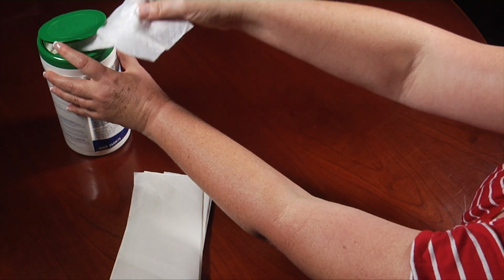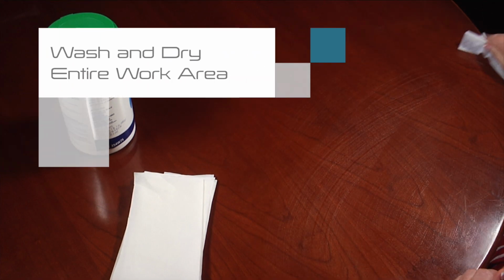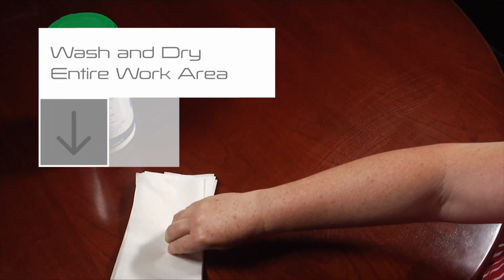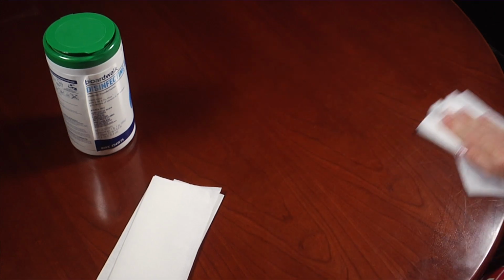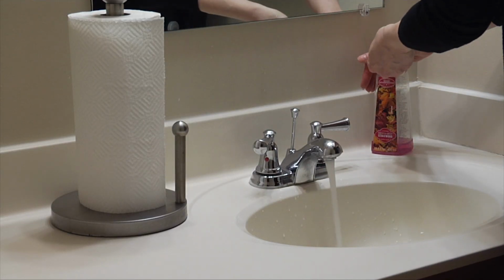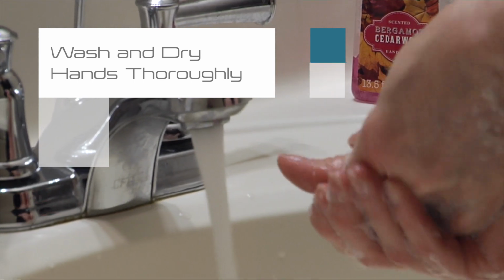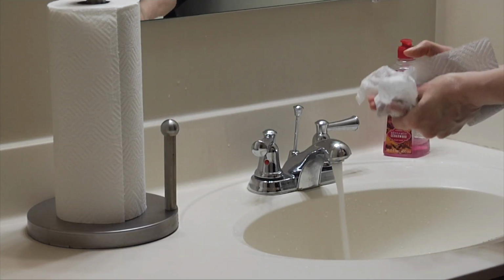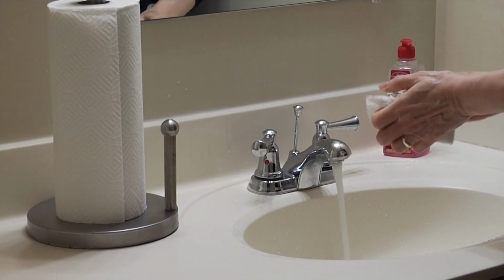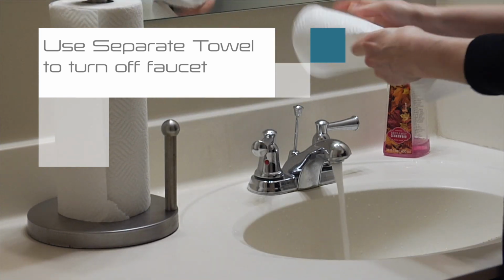Please begin by preparing your work surface by cleaning the area thoroughly with soap and water or a disinfectant wipe, and drying thoroughly as well. Wash your hands thoroughly for at least 20 seconds, and dry as well. Use a separate towel to turn the faucet off.